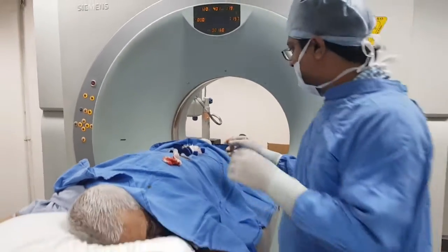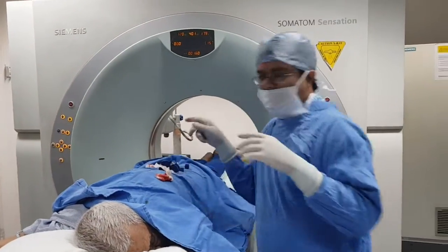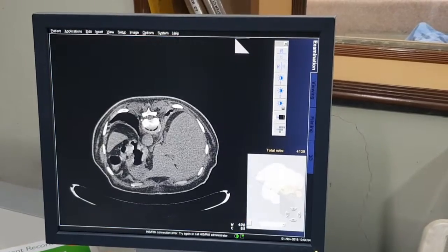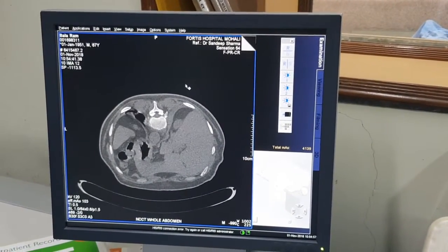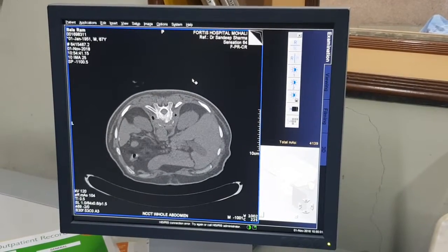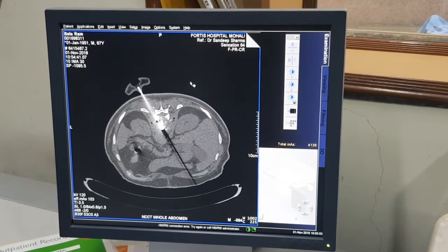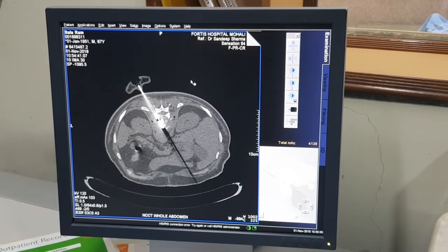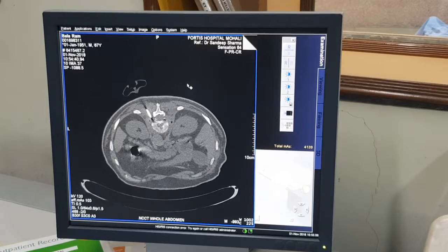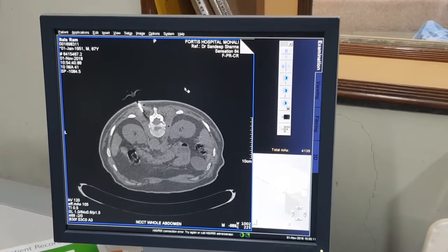Now we would like to see where we will remove both of them. See where the needles are. One is up to the vertebral margin, the other one also. So both are up to the vertebral margin — we will remove them now.